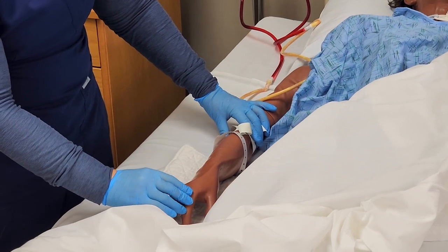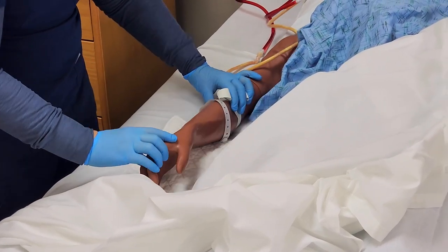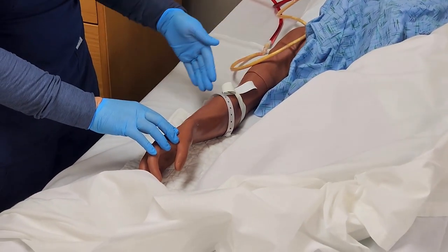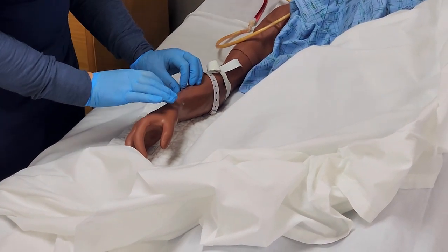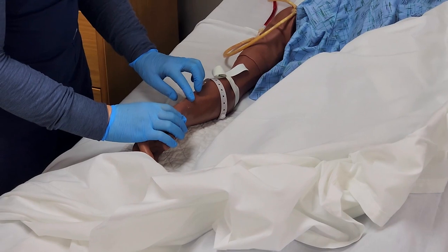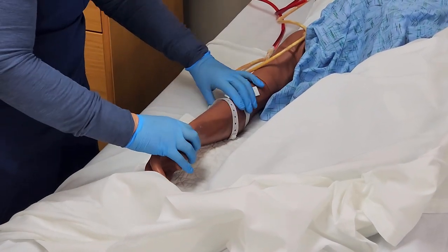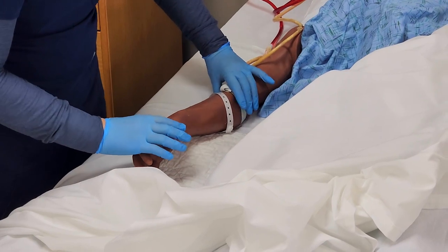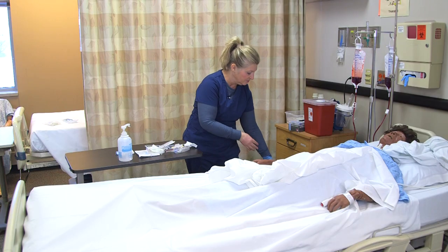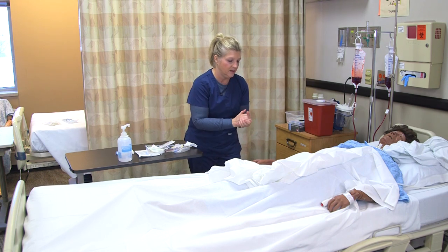The veins in the hand look fairly good. I can feel one that has a few bumps that might be a valve, so I'll go up a little further. You generally want to start more distal so if unsuccessful, you can move up the arm. I feel a vein that is soft, flexible, and bouncy with no valves. I put the arm in a dependent position and release the tourniquet.